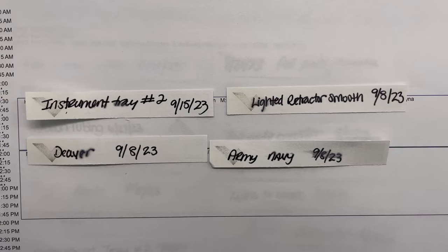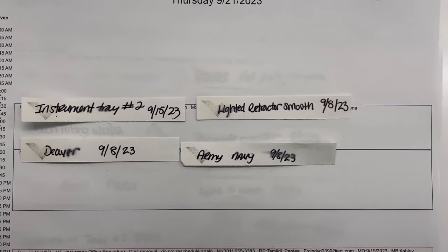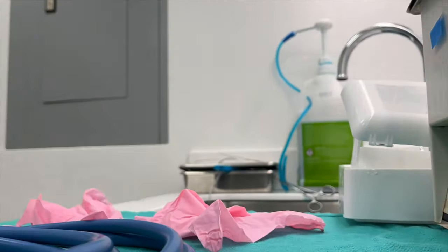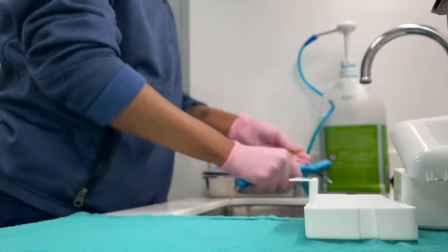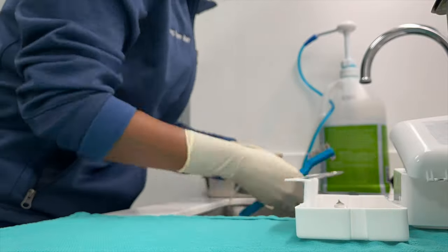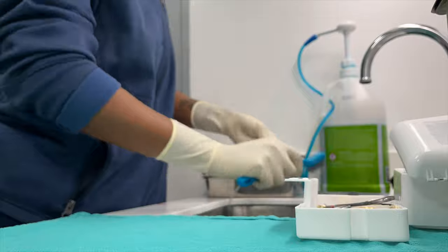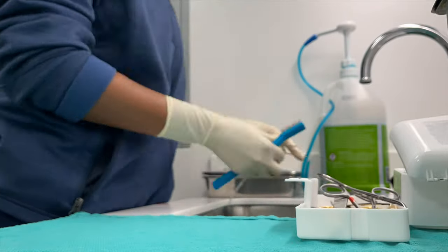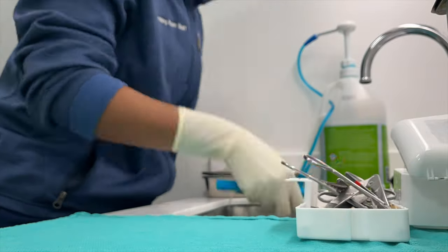So then after that, I take all of the indicators that came from the instrument pouches that I opened, like the sterilizer indicators, and I save them. I make a copy of the schedule and put them all in a book just to keep track, to make sure that whatever instruments I use were properly sterilized. If a patient has a surgical site infection, we can go back and check, was this properly sterilized? It will be shown that this specific instrument did pass sterilizer tests and all that good stuff.